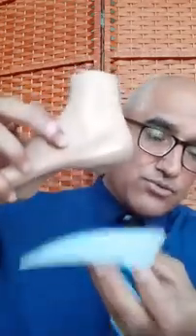So for example, if the patient has, let's say, a calcaneus spur or plantar fasciitis, it is very important that we cushion the heel. So we cushion the heel, and at the same time we also elevate the heel. So elevation can be done with the heel raise, a silicone heel. At the same time, it also cushions the heel. So that means that the heel will have less impact from the ground. So there will be less pain.